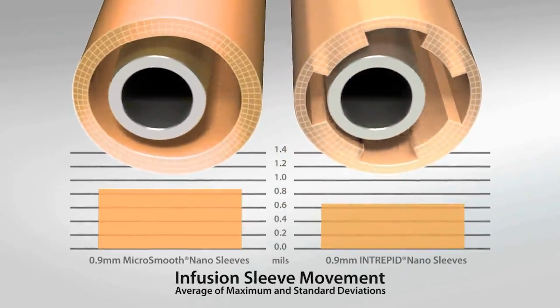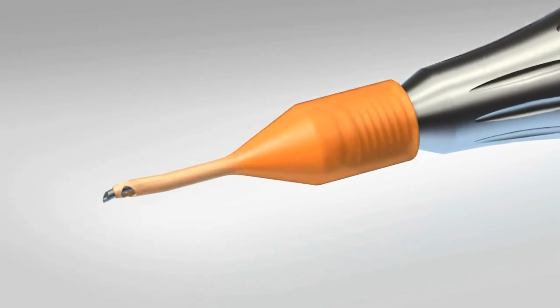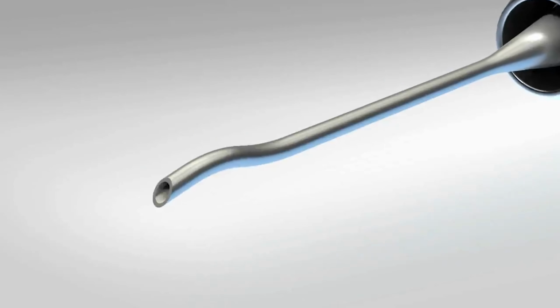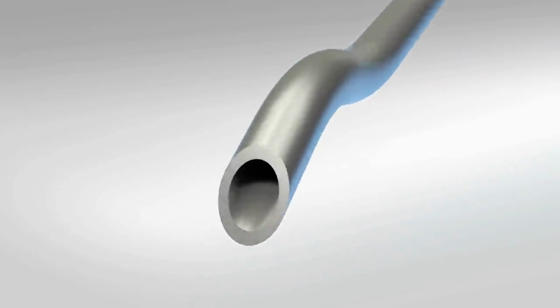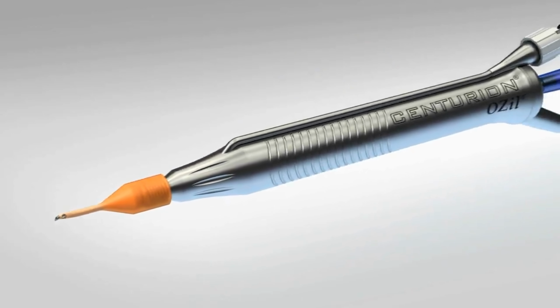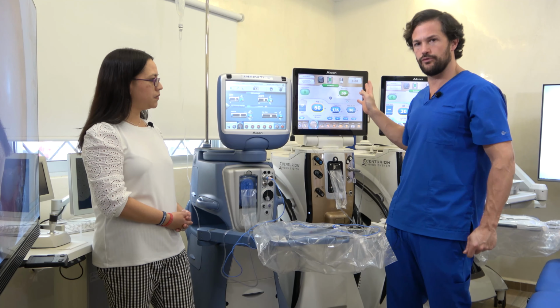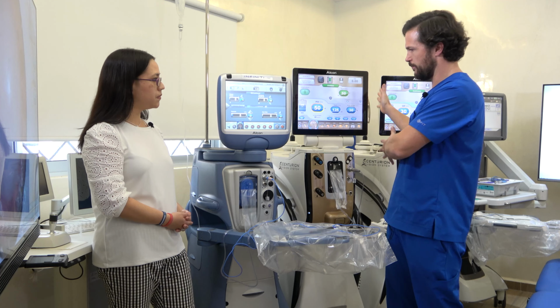Ivo said. Excellent. So remember, guys, to do something very simple, longitudinal ultrasound was like this. Torsional changed it completely. It was more efficient. The tip changed to a Kelman tip to be able to do torsional ultrasound, so we had a more efficient delivery. Very important in this case, in Infinity, for sculpting or even quadrant removal, we were used to using big numbers, right? It would be 90, 100 of ultrasound, and that will change with Centurion. That's important to know.